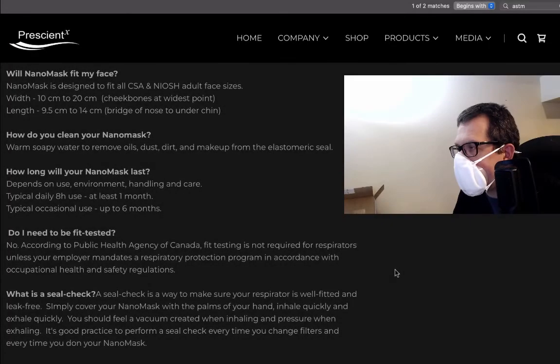Going over some of the information on the web page for the nanomask. There's a note about how long you can use the mask: if you're using eight hours a day, at least a month. So basically if you're using it every day, change it every month. If you're using it for occasional use, then six months. So one to six months.